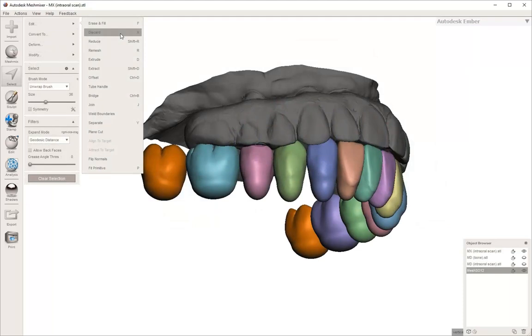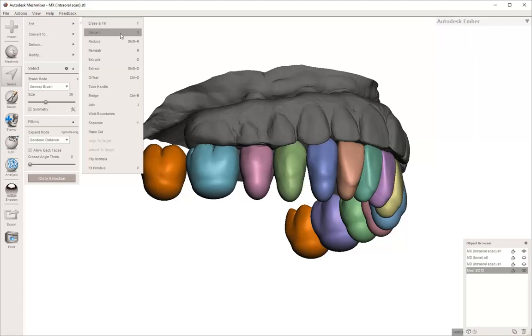But since this patient doesn't have any maxillary second molars, we're just going to delete those. So you do the same thing: use your select tool to click on each of those teeth, hit E on the keyboard for expand to connected.